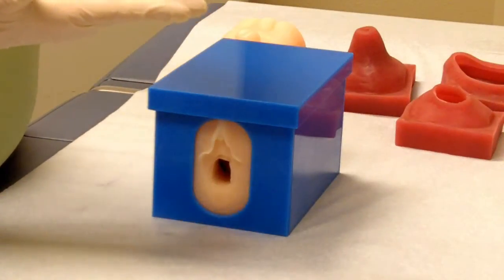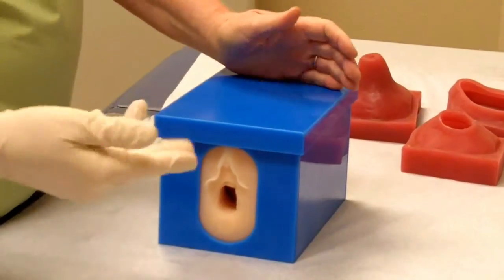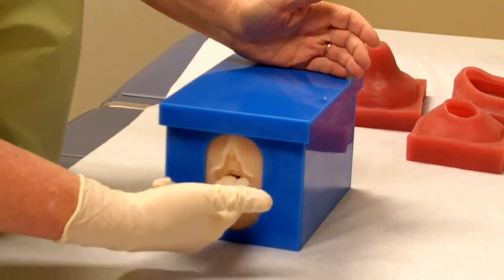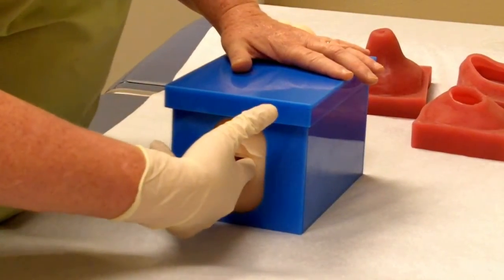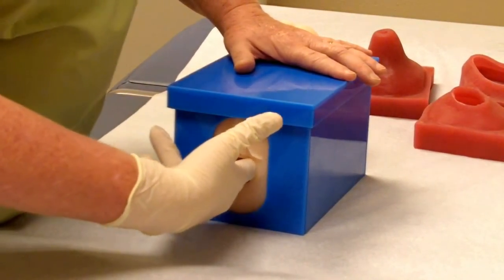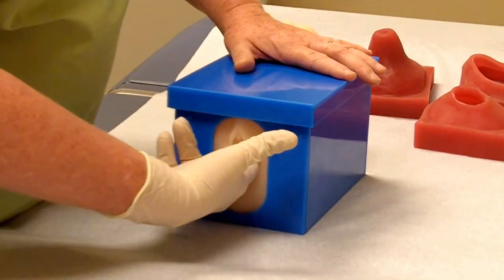When someone is getting ready to do a vaginal exam, you will have a sterile glove and you will have lubrication on your fingers. You will then place your fingers in the vaginal introitus and gently introduce them until you feel the cervix.